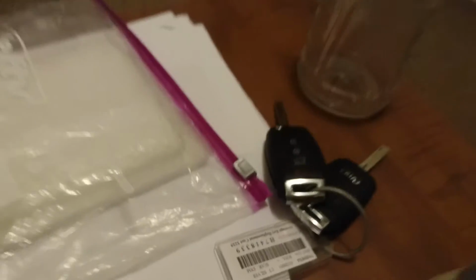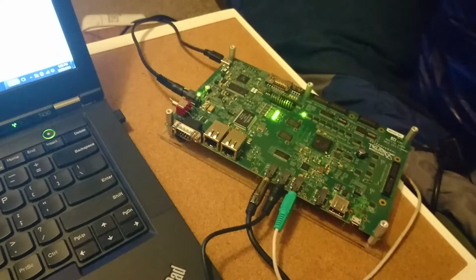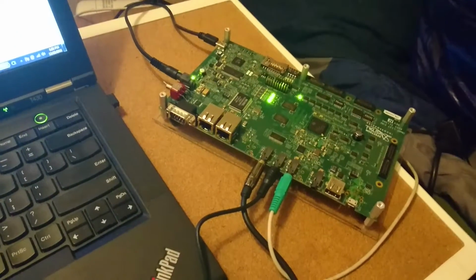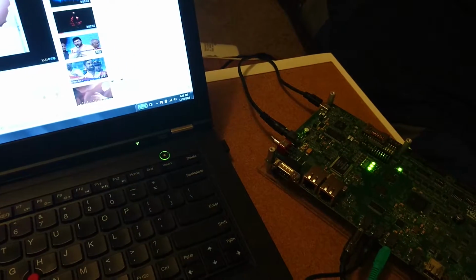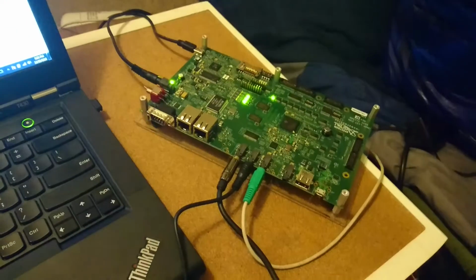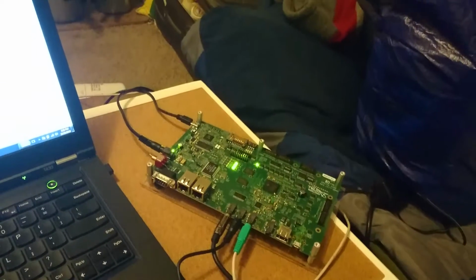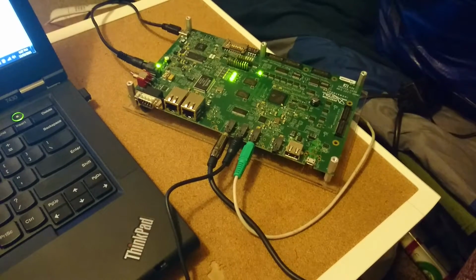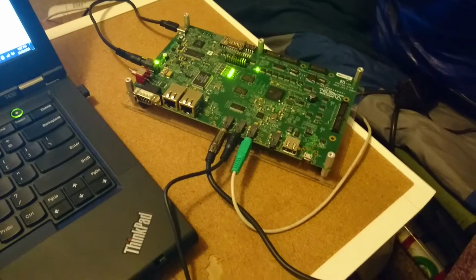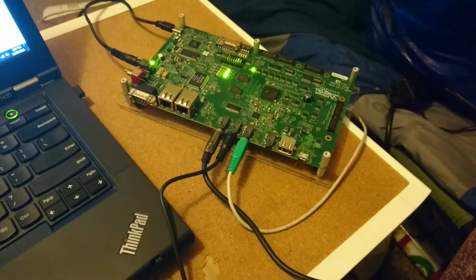So now, using these two signals which are available, we can apply the LMS algorithm, or before doing so we can also improve the gain of the signal so that we can perform processing in a better way without losing the signal. This is the demo of the project for digital stethoscope, and the future enhancement could be application of the LMS algorithm and also gain modification, which would be a good thing to do.